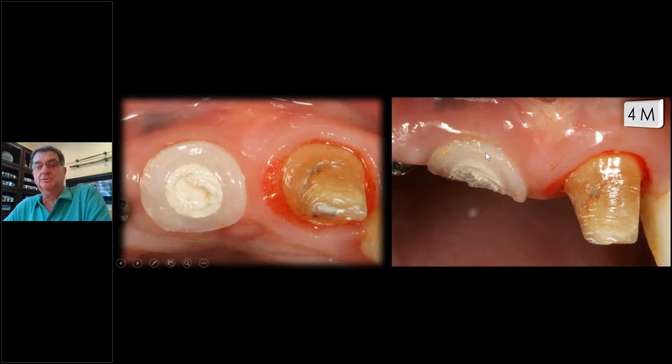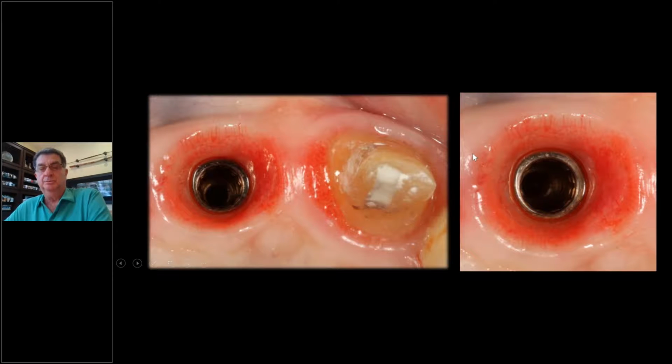Of course, we get a little recession because the tissue was so inflamed to begin with. It was not perfectly healthy from the old bridge that the patient came in with. So you see now we held the tissue out. And look at that beautiful tissue. Now this is even without the temporary on it. There's just the bottom half of the temporary. The custom healing abutment should be what you do because now you're ready to make an impression, aren't you?